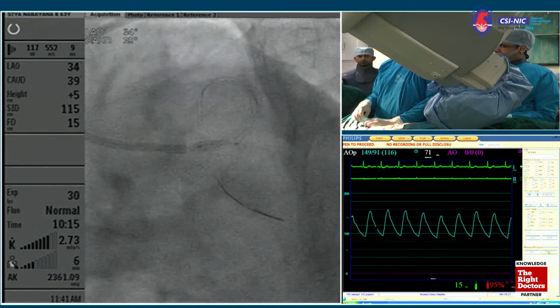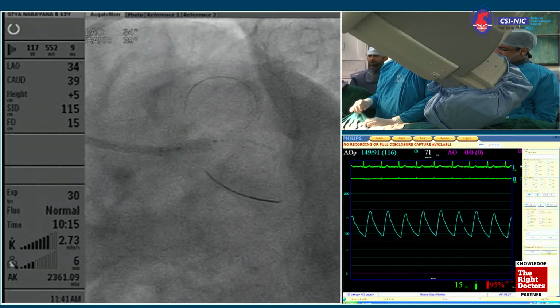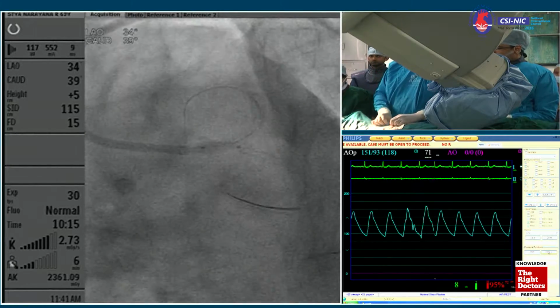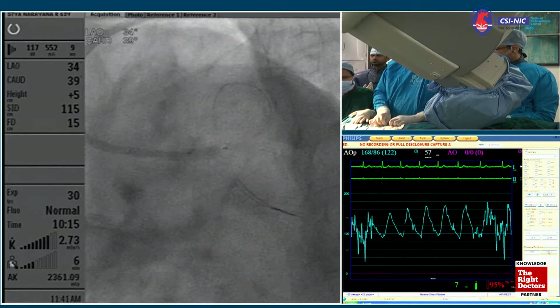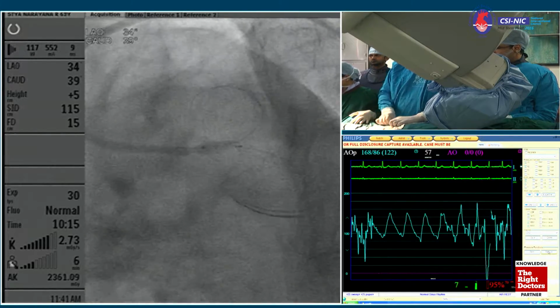So when you come back next time, we most likely will have you got another 2 minutes if you could continue. Okay, wonderful. What is your plan? Is it going to be culotte or going to be TAP? My plan would be one stent, if it's possible, because there's not much disease in the LAD. Sorry, I didn't hear. What your plan is? One stent, if possible. One stent? One stent. So you leave LAD.